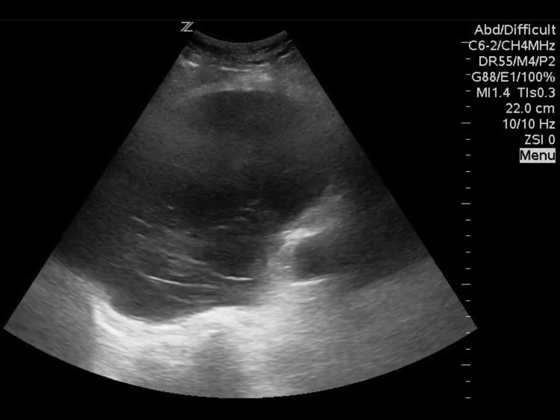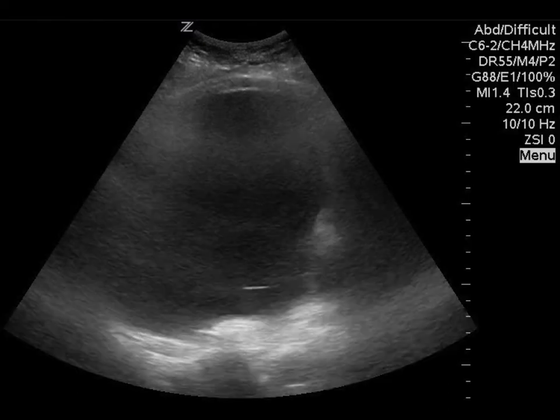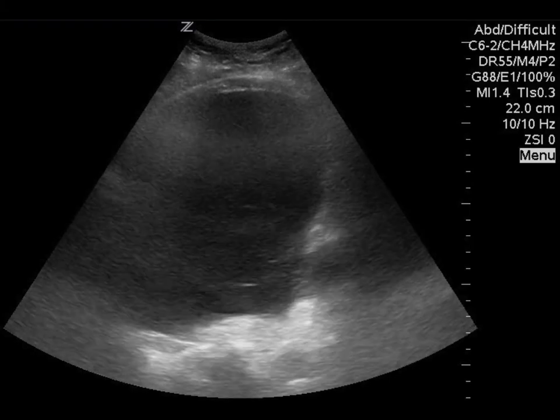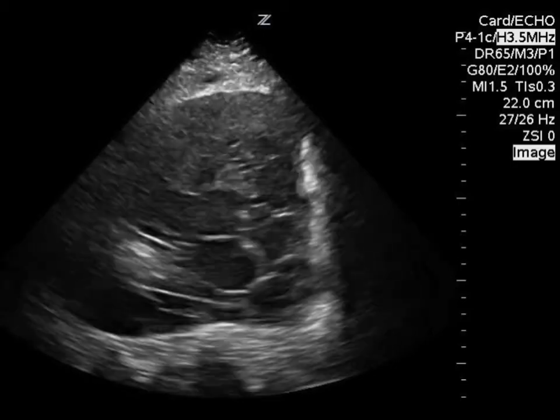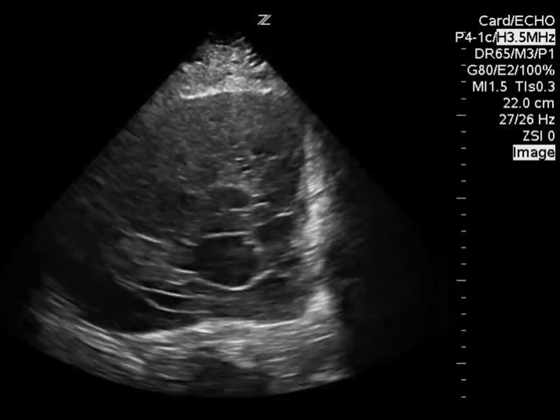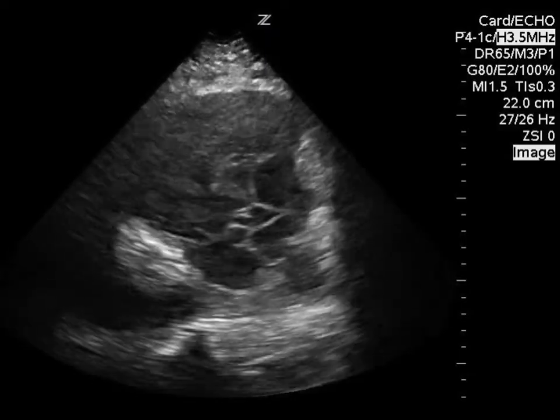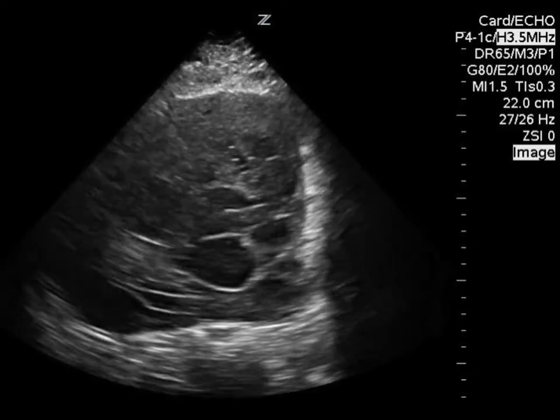Well, I wasn't sure if I really wanted to go in and poke this, and I thought, well, it could be pneumonia, and maybe this is a parapneumonic effusion. But why don't I have one more look at it? And when I had one more look, I actually had the phased array probe. And this is the exact same position on the same patient 15 minutes later. Now do you want to poke this? Pause for effect. I hope the answer is no.